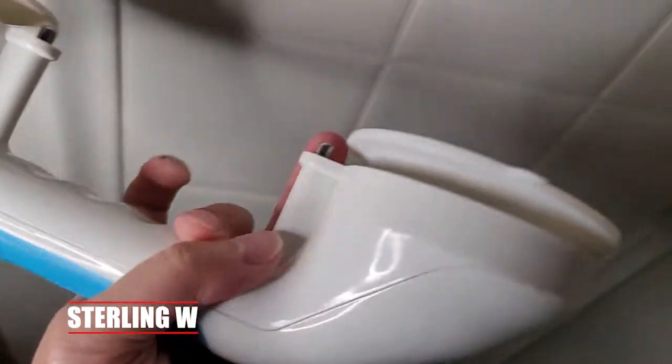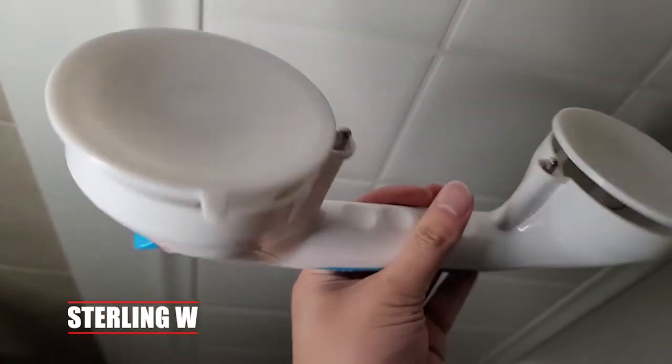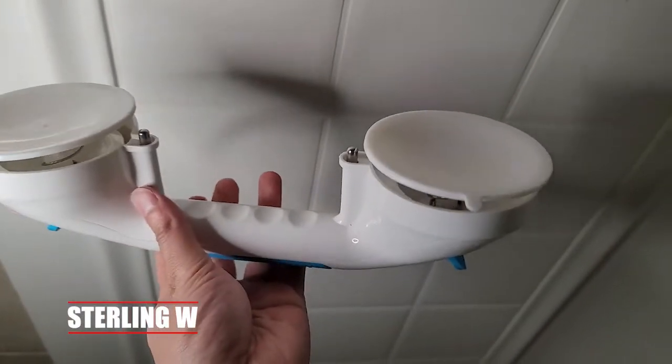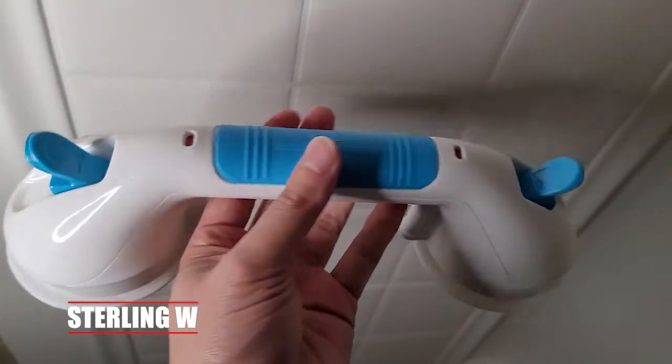This is pretty good. It's straightforward, pretty easy to use, no tools needed. You just make sure you have enough strength to push those two thumb levers down to have the suction in place. And prep the surface with some alcohol to clean up any grime for better suction.